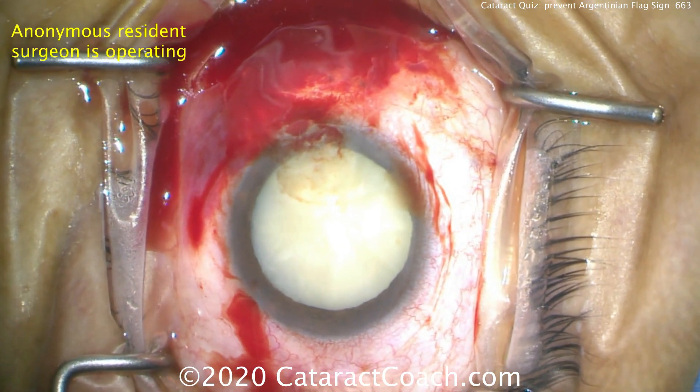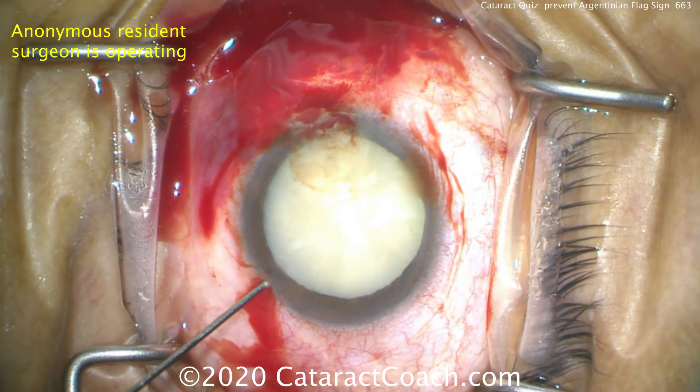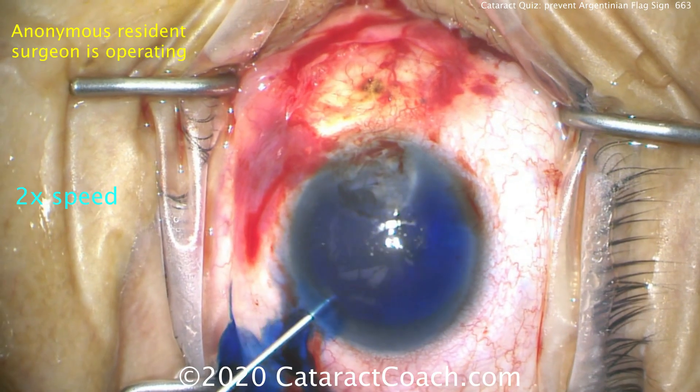Let me show you this case. It's a patient with a very white cataract — a relatively young patient. Look at the eyelashes, looks pretty young to me. More likely to have an intumescent cataract.